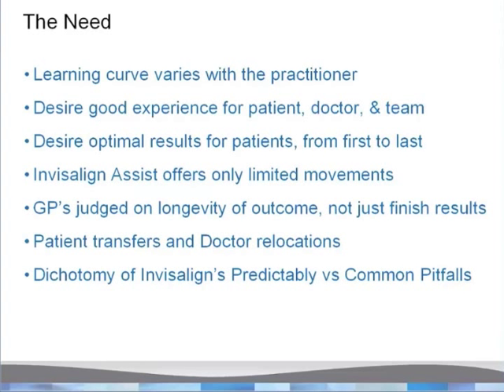The other thing that relates to the need for a template is the fact that we are all general practitioners, and the quality of our case outcome is judged not just by the finished results, but we're going to be seeing these patients for years and decades to come, and they are looking for a long-term, stable relationship in their occlusion, and that's part of the template design as well.